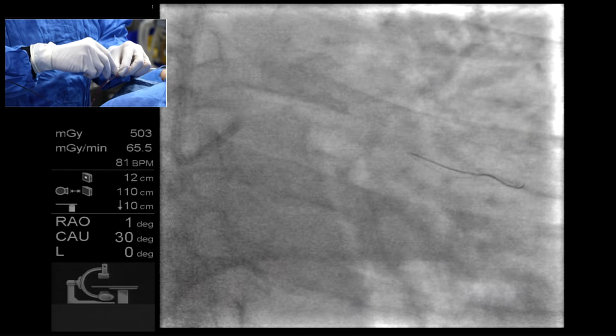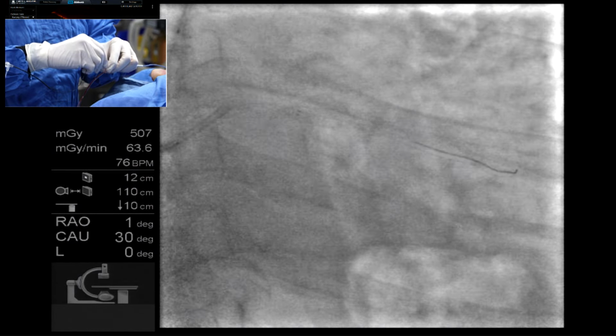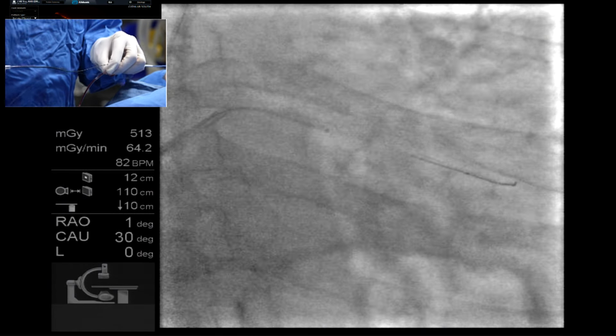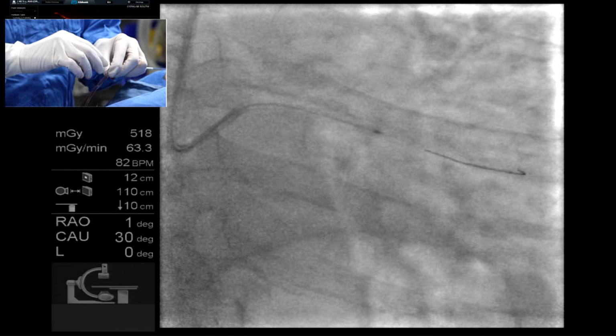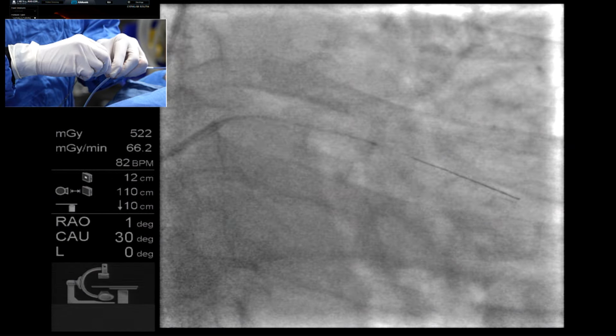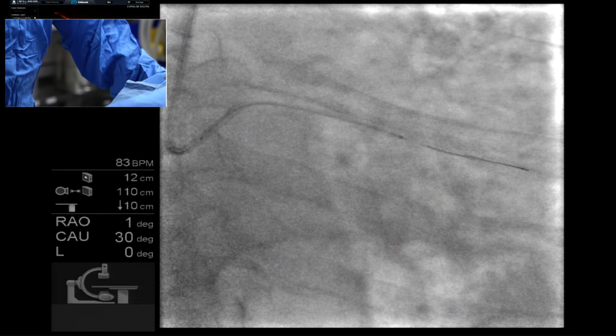The distal wire doesn't want to go in the main channel, does it? No, I am not trying to push it hard actually. Here also I will be careful. I have my eye on the distal tip of the catheter. Yep, that is pretty injury prone. And I think we have the area of interest available here. That's good now.